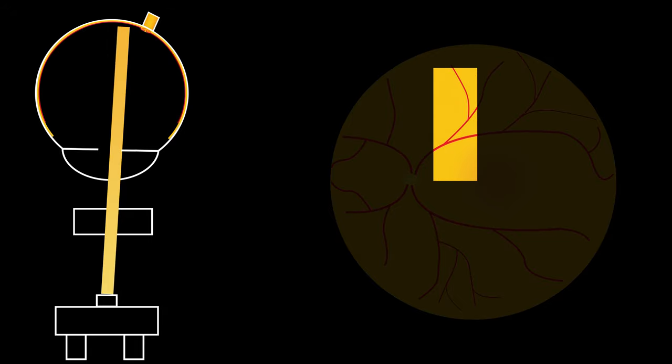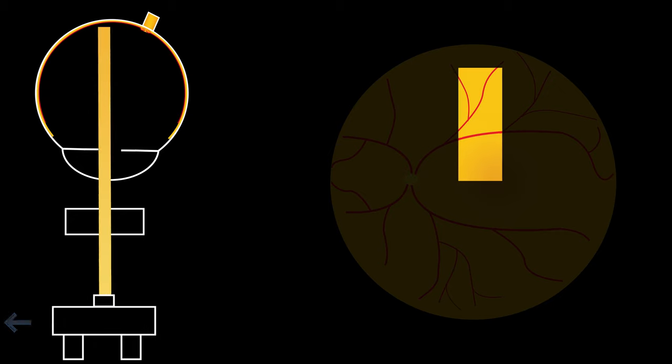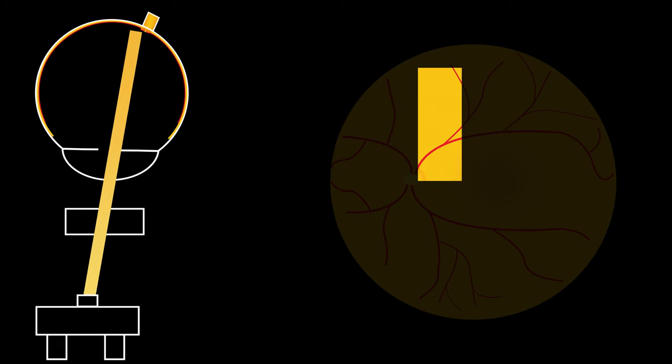We're definitely closer to the optic nerve now but not completely there yet. So we need to move the lens once again. And once again it takes us back in the wrong direction but we keep doing it anyway.